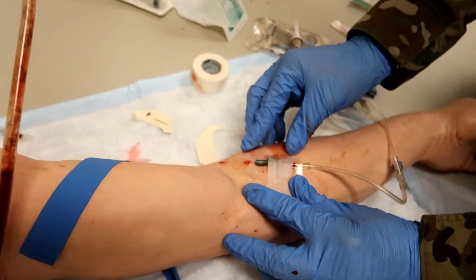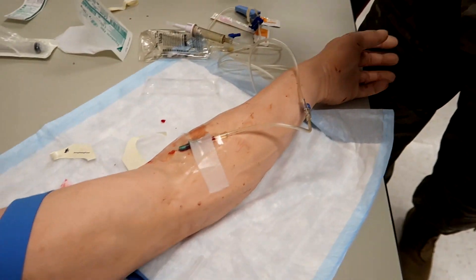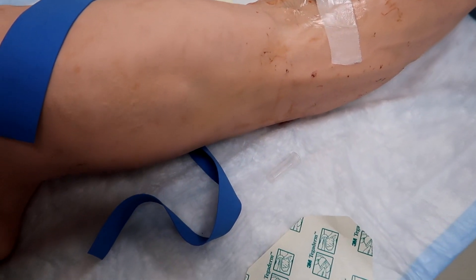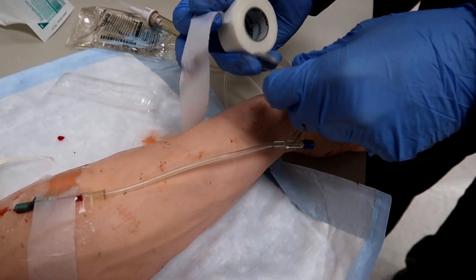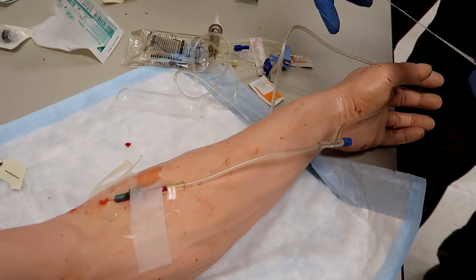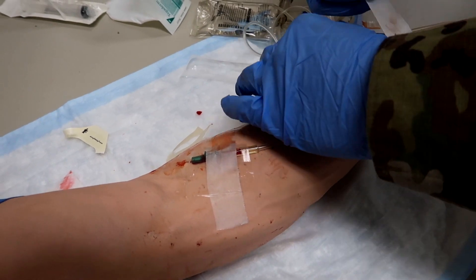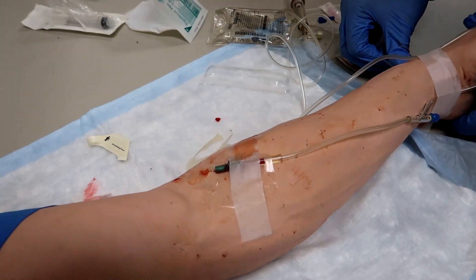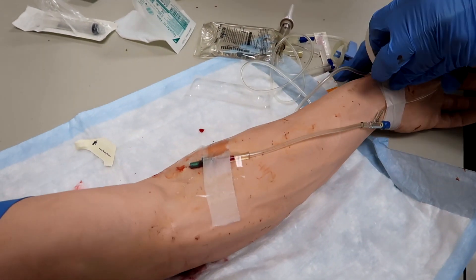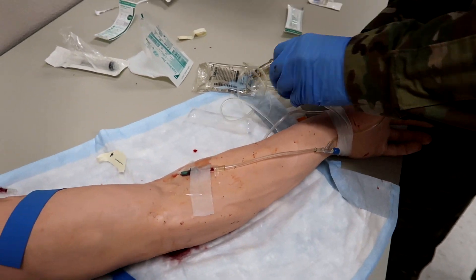Bam, transparent dressing is done. Now he will secure the tubing to the casualty. A good way to do that is with one inch tape — some people even wrap around the wrist and thumb so if they get snagged on something it won't fly out of their arm. If any of your instructors grab your bags and toss them to see if it holds, that's a real test. Our instructors used to literally grab people's bags and throw them across the room to see if we'd secured the IV tubing correctly. There you go — IV tubing secured to the casualty.